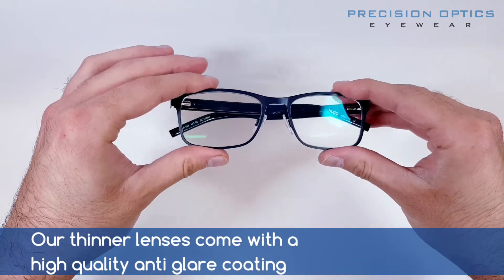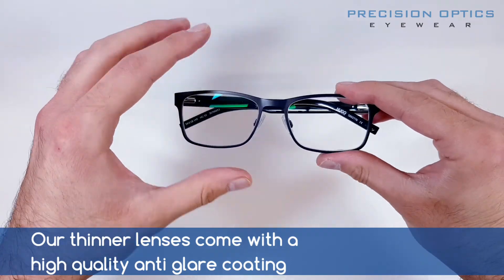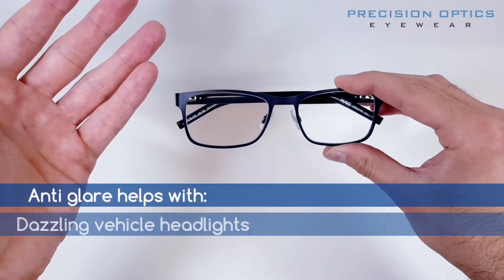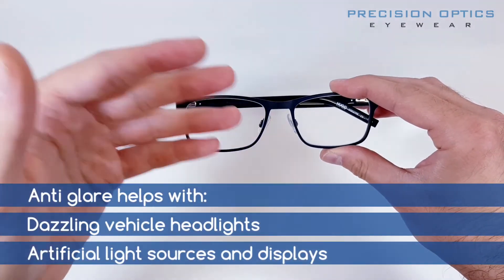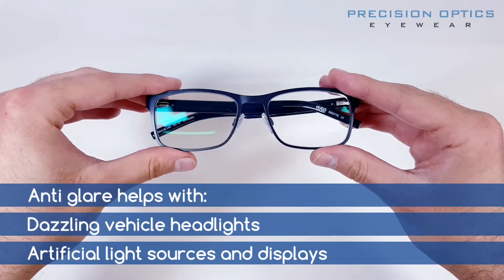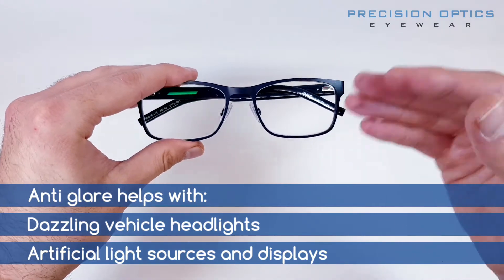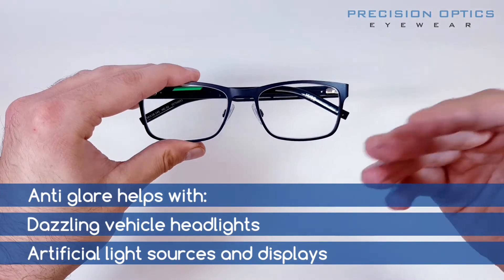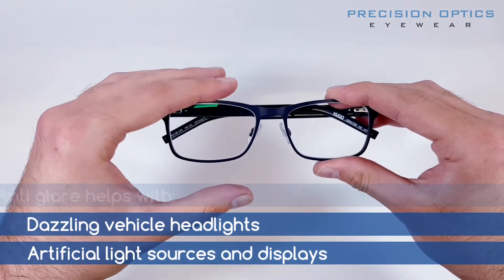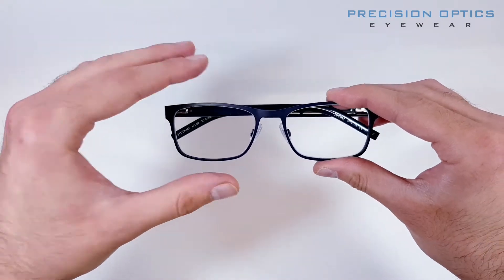With our thinner light lenses, we always apply an anti-glare coating — that's the green reflection you can see. This coating is going to help keep things crisp and clear. When you're driving in the evening with car headlights or street lights, this coating keeps everything nice and clear. It also works in and around artificial lights, computers, mobile phones, and tablets — giving you a crisper and clearer image.